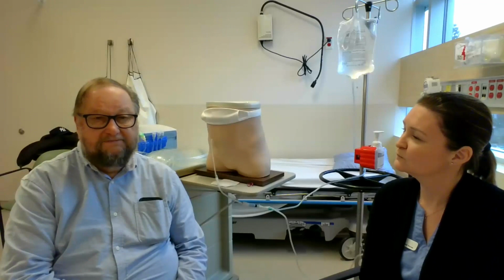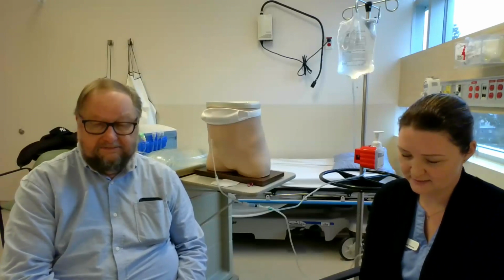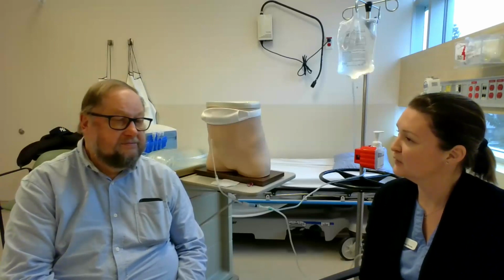Because of some previous abdominal surgeries that I had, it was decided the best way of inserting the catheter for me was through a surgery here at the hospital. And that's what happened. I had no real pain after it was inserted. So it was a pretty easy procedure to go through. Oh, that's good. What was training like for you?